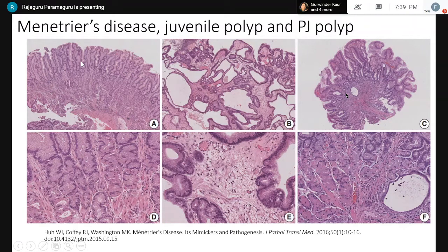It looks hyperplastic and thickened. Whereas in a reactive gastropathy, there will be loss of this foveolar mucin, and the epithelium looks more simplified and attenuated. So in that way, you can differentiate, and definitely the endoscopy is going to be different from a case of a reactive gastropathy.